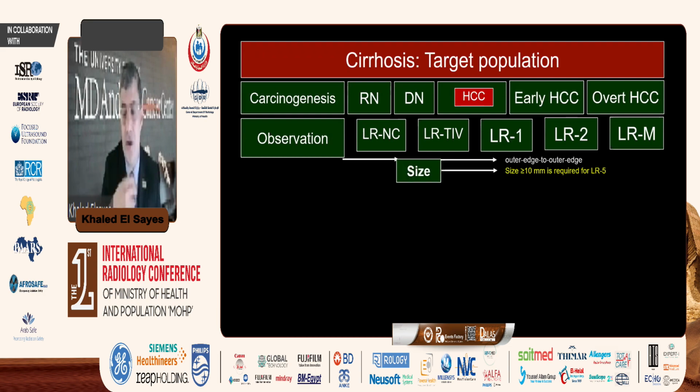In general street language terms, the fibrosis eats up these benign lesions. So as we said previously, you go to the major features, right? After LR-M, and I showed you some pitfalls of LR-M, and some examples of how you measure the size, how the size is very important, you measure the outer edge, and a size of 1 centimeter or more is required to categorize the mass as LR5.